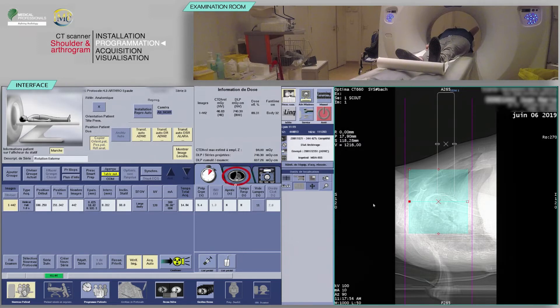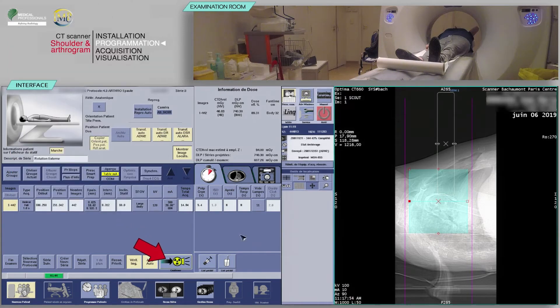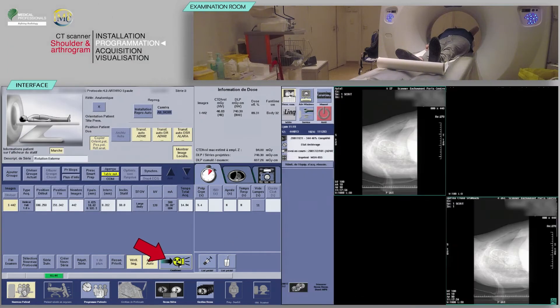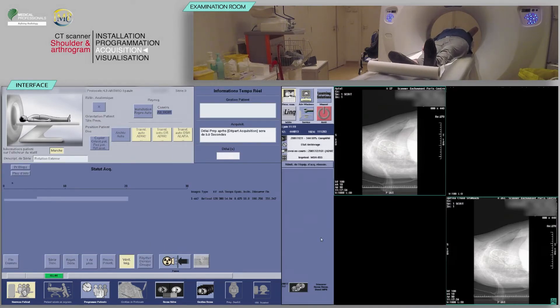Next, check the reconstruction boxes. For the acquisition of a shoulder CT, you will need at a minimum a sharper or edge enhancement reconstruction filter for bone study, and a smooth reconstruction filter for the soft tissue study. Click on Confirm. On the keyboard, move the table and scan when the buttons flash.